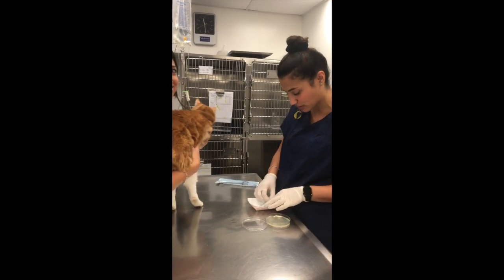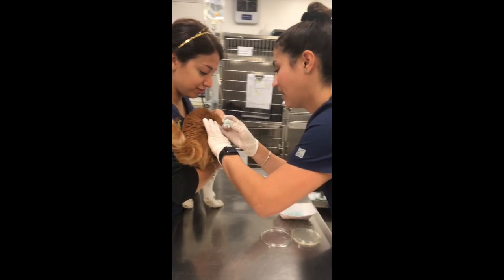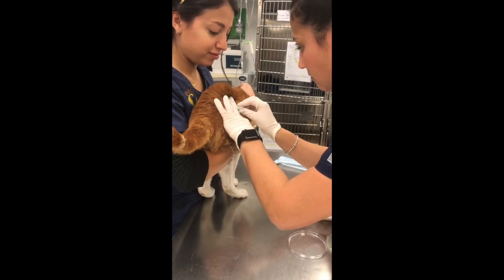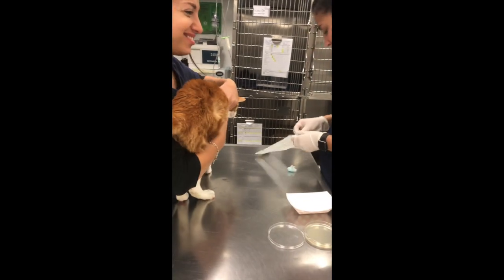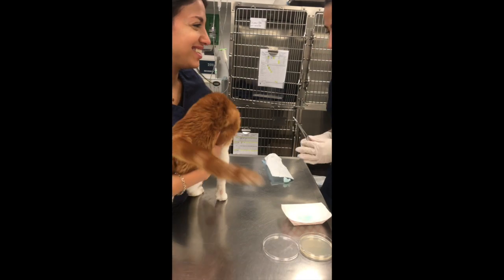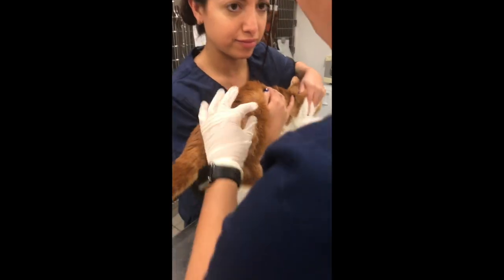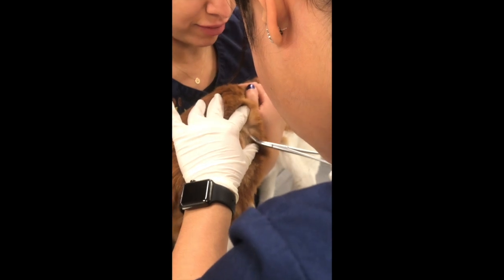You ready, bud? First I'm just going to scrub a little bit just to get off the excess debris. It's okay, kitten. You're going to be good. I know, you're a good cat. That should be just fine. I know. I'm sorry, Captain. You're going to be good. Don't worry. Now I'm going to pluck just about 10 to 20 hairs if I can. That should be more than enough.